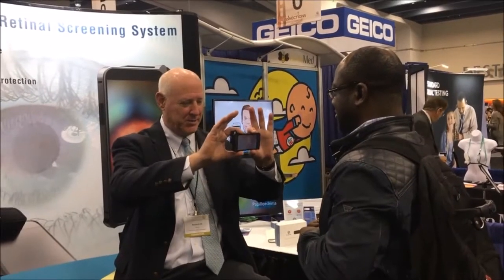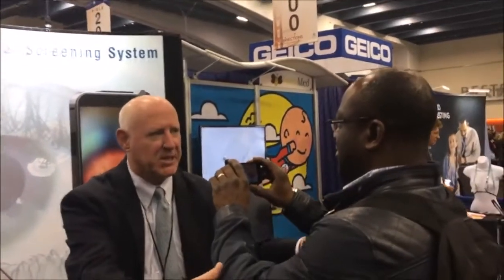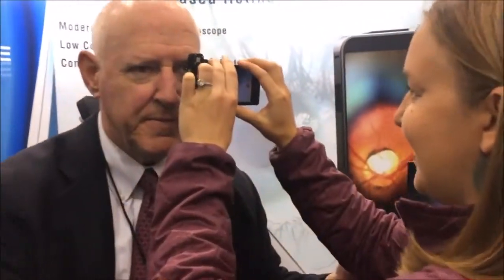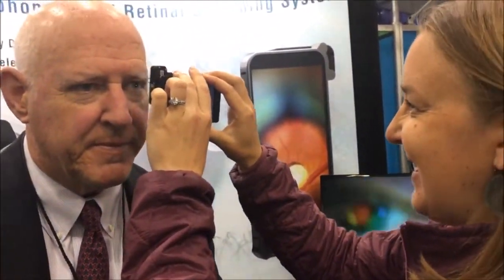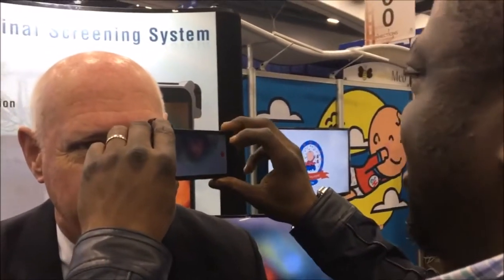Hold it like this, and now tell me when you get my optic disc. Do you have my disc? Yeah. Fantastic.